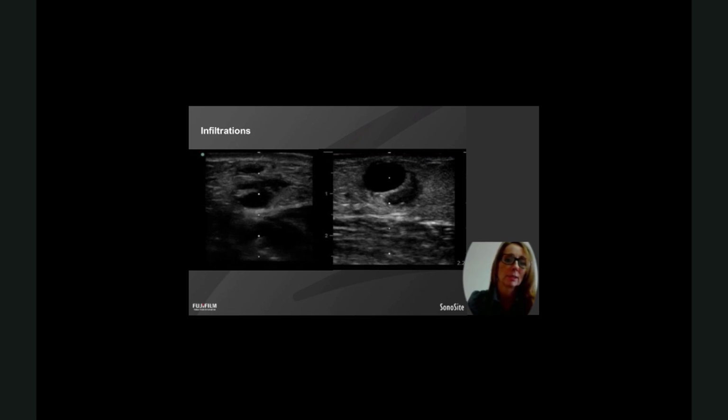So the first one on the left, there was a whole lot of hematoma sitting over the vessel. The staff were palpating to cannulate and feeling the hematoma and thinking that the vessel was actually quite shallow, but it wasn't vessel, it was hematoma. And they were trying to repuncture in that area and not getting any flashback, so started to change the position and cause more trauma and hematoma, because they didn't realise that the vessel was actually too deep through the hematoma to puncture.